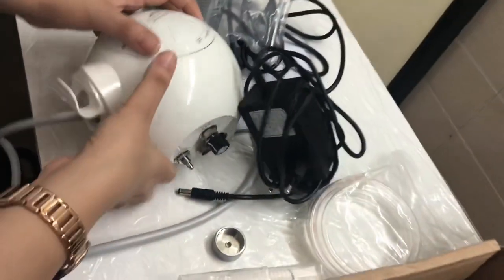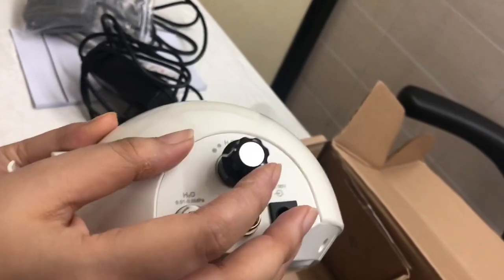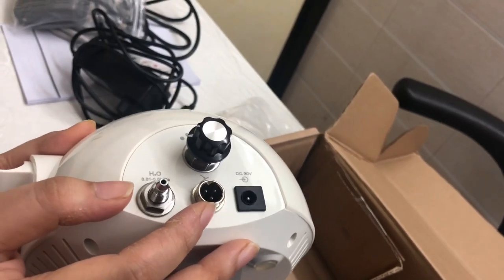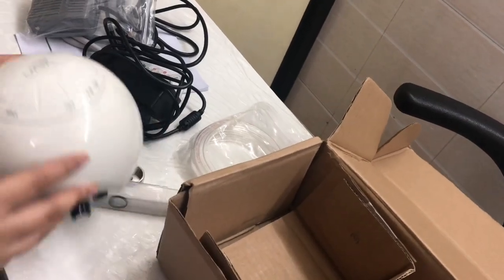So let me tell you what the parts are inside. This is your water control switch, this is your socket for power, this is your socket for the foot switch, this is your water entrance, and this is your power knob.